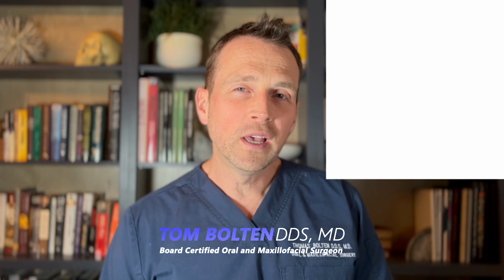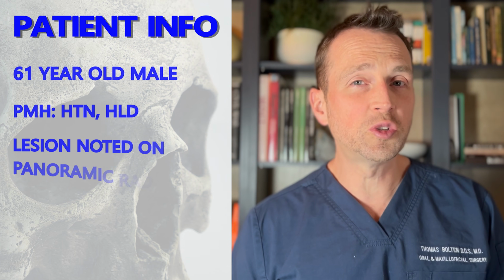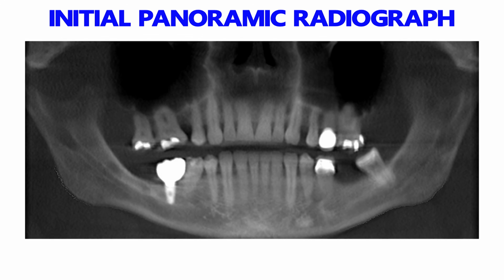I'm Dr. Tom Bolten, and today we're removing a lesion in the top jaw. This patient is a 61-year-old male whose dentist noticed a suspicious lesion on the radiograph at his last appointment. He doesn't have any pain, but he's noticed that the roof of his mouth feels like it's gradually getting bigger.